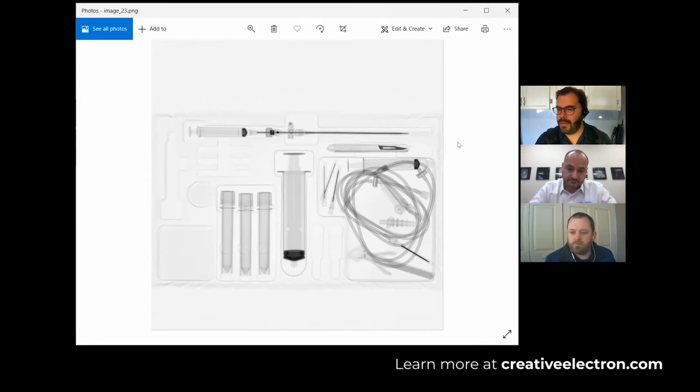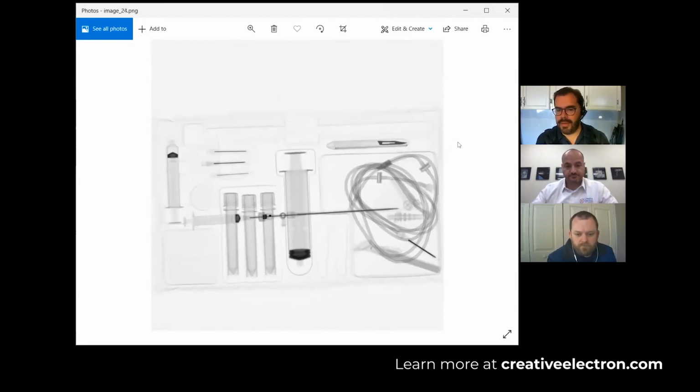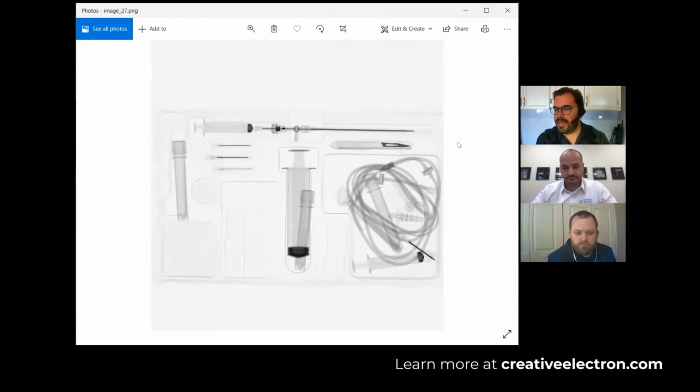Basically, you can't see through this object. It's a white bag. Even with the most powerful backlight, there's no way that you can see it. You might be able to see some stuff, but once you get on a different angle, then everything gets really complicated. So you can see here how clear the image looks. You can see, as components shift around, you can know exactly where they're at.